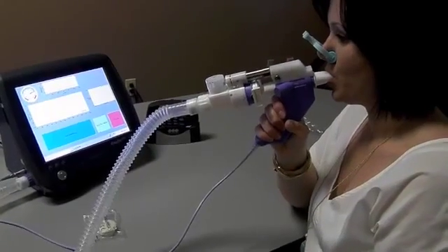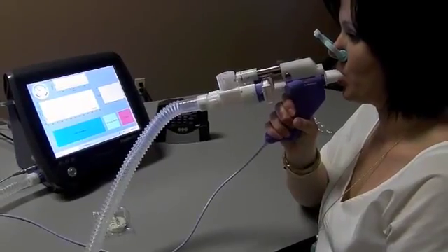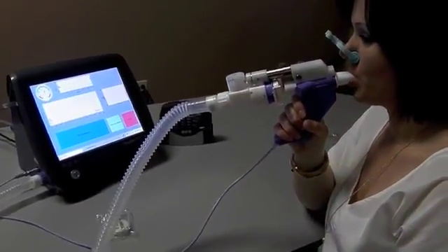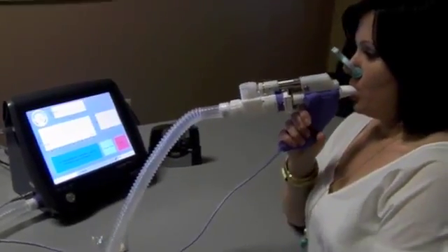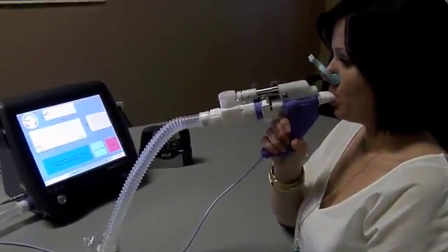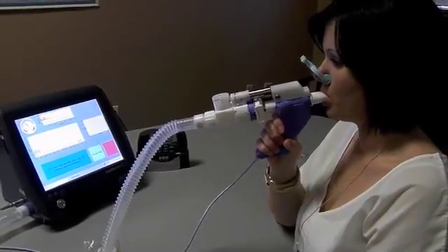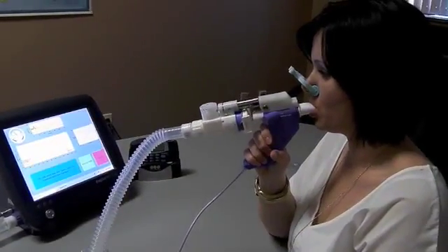For this part of the phase, we just continue doing tidal breathing, and we have this machine set up to do a linked maneuver. So now she's going to perform a slow vital capacity, taking a deep, slow breath, now exhaling completely, fully exhaling.